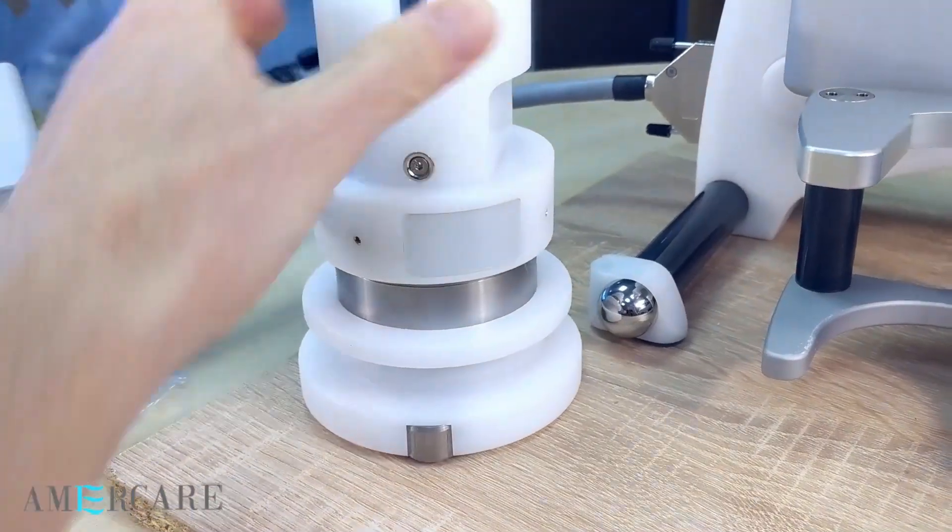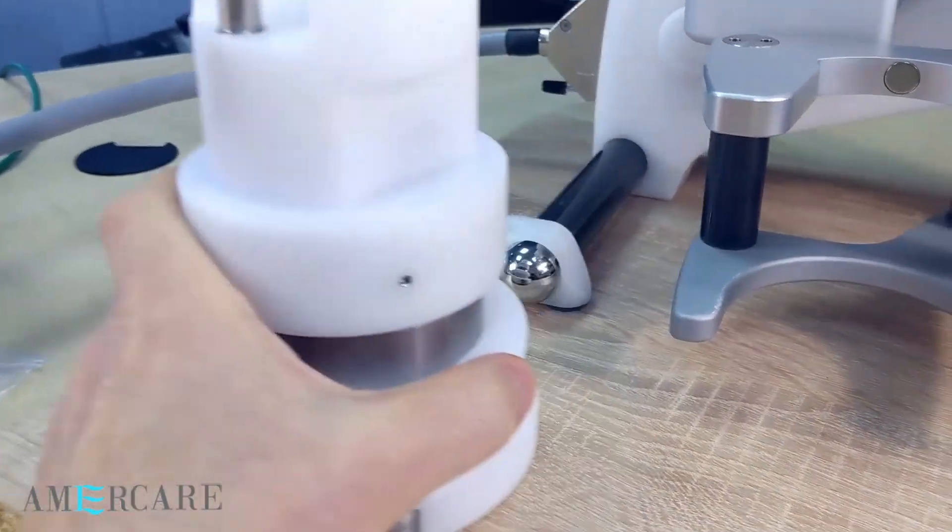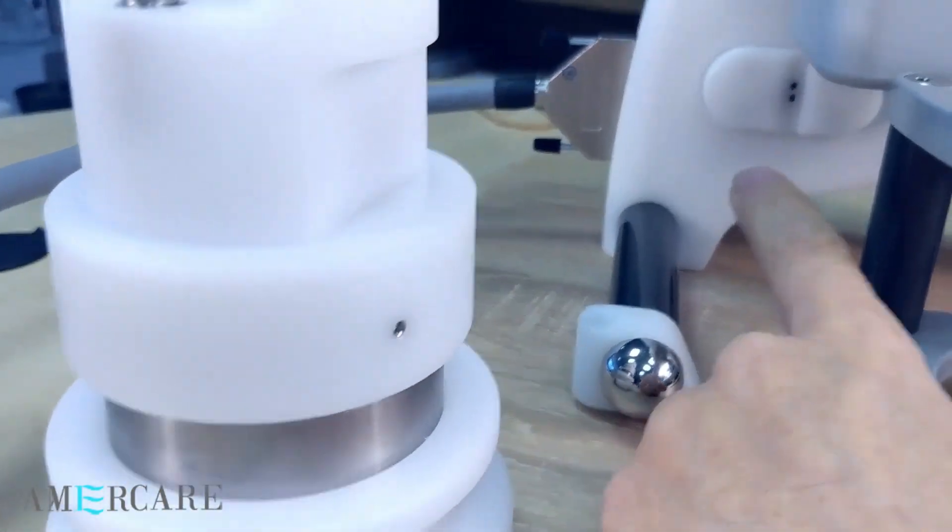The side of the vial shield has a reflective area here. When in position, this is picked up by the optical sensor on the body.